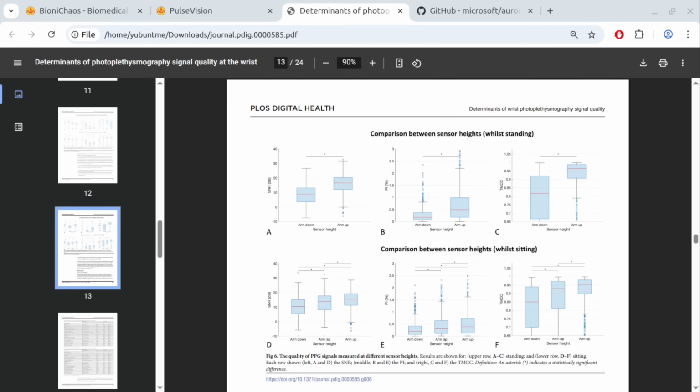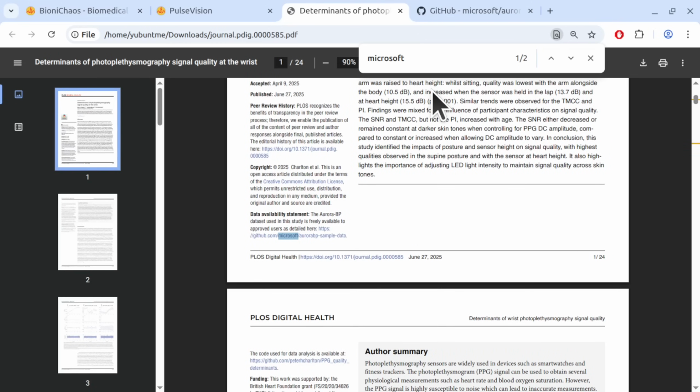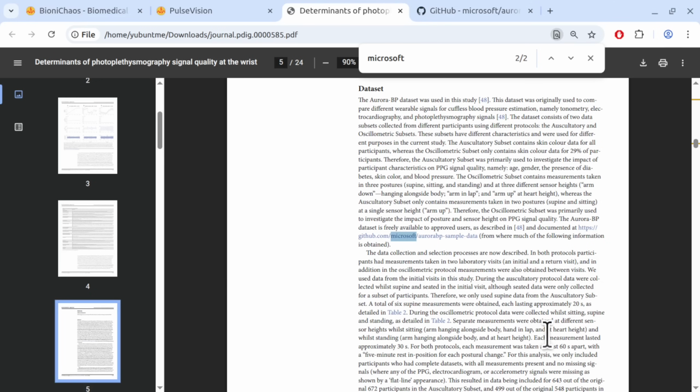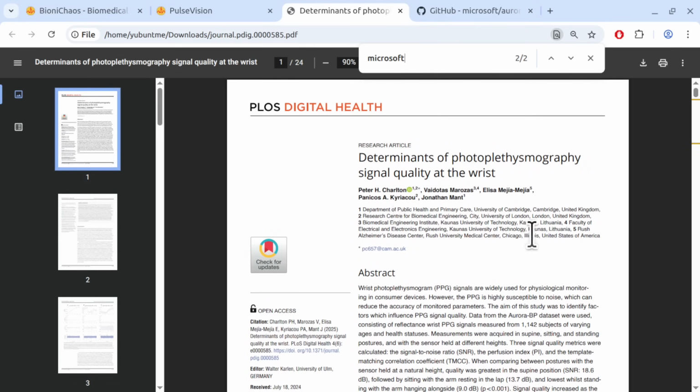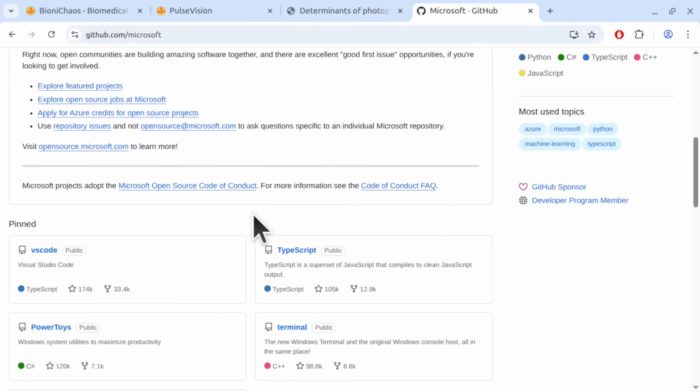It's important to understand this is only a sample. Is it the Microsoft research paper? I don't get it. It's only mentioning Microsoft once. Is this some sort of weird conflict of interest or something? Because it says that's the title of the paper. They don't say it's Microsoft, but the GitHub repository is supposedly Microsoft's. That's a bit weird. Yeah, it's a Microsoft repo.